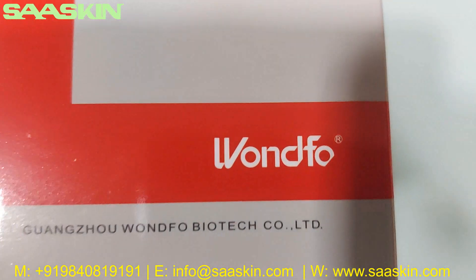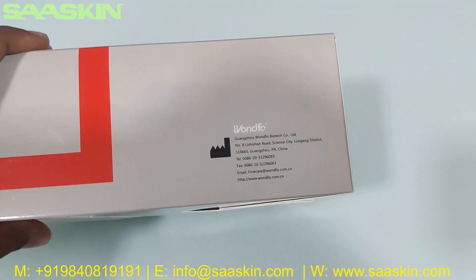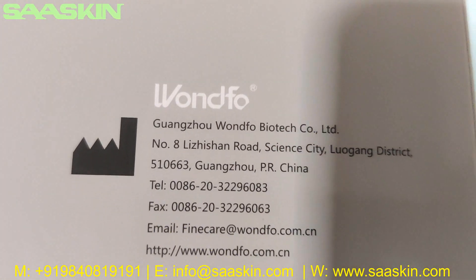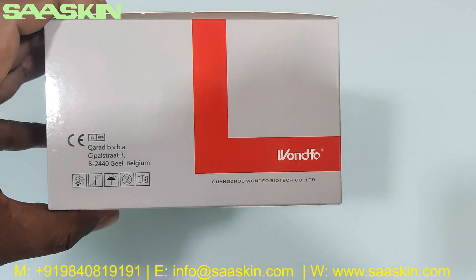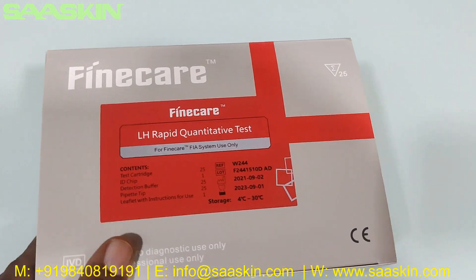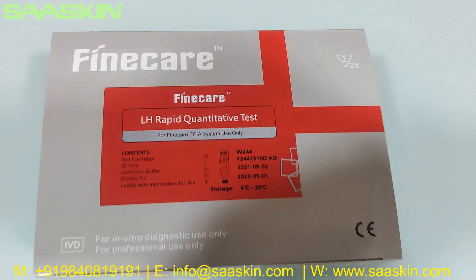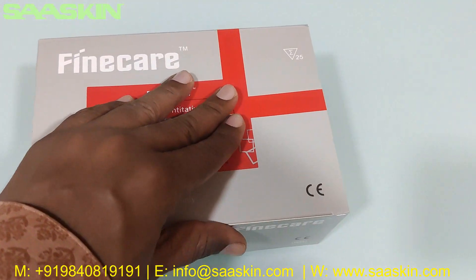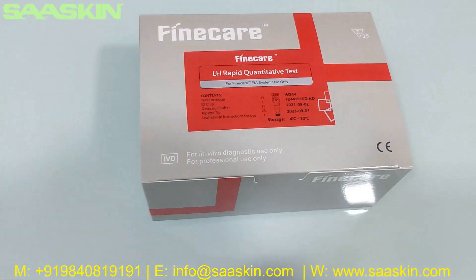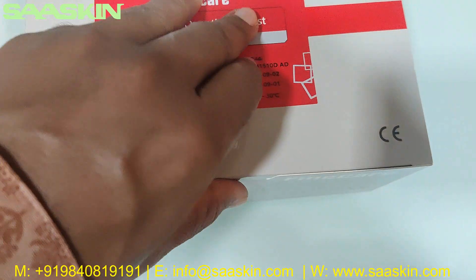This product is from Wunfo — you can see it here. This is the Fine Care LH Rabbit quantitative test, and I am going to open this box for you now.